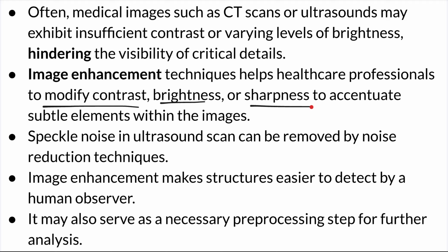They are trying to hide certain but critical details. So by enhancing your image, these details become clearer for you to see. And some of these things, as I said, you sometimes have to have the skills because you know that, oh, let me decrease the contrast and I'm able to see. And the more you play with this, the more you're able to understand some of these things.